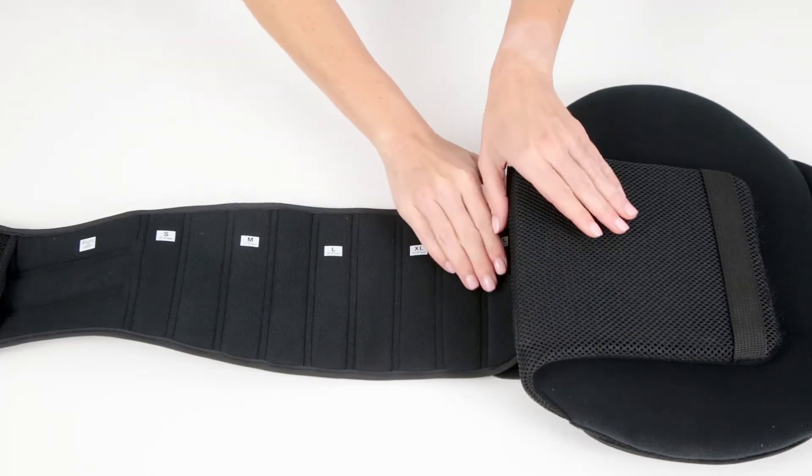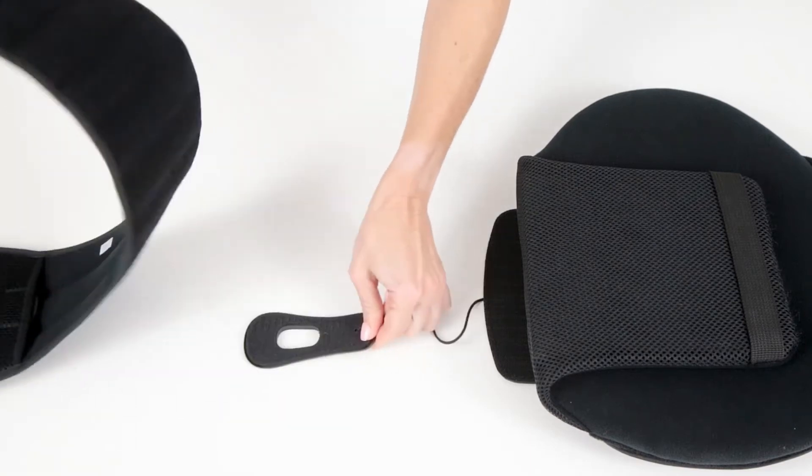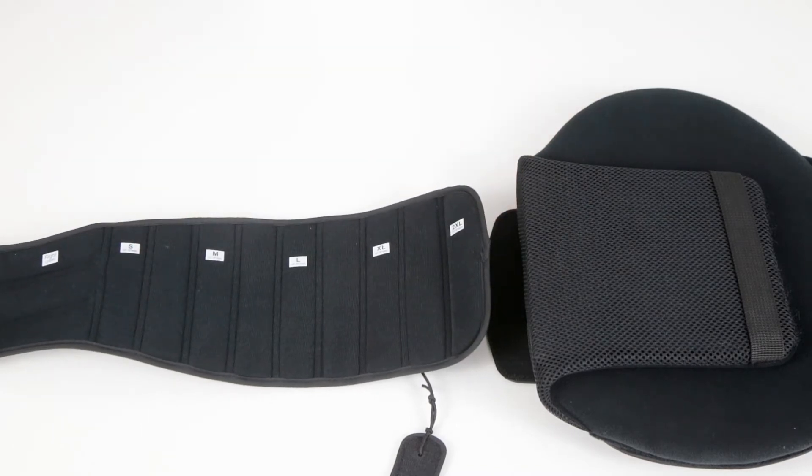To adjust the size, open the back panel cover and disconnect the fabric fasteners on each side of the belt from its tab on the back panel.